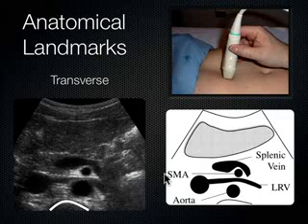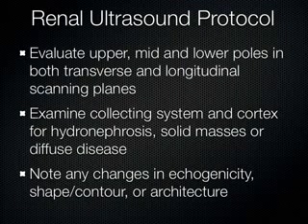So here's the left kidney, not seen on the screen. It's over here on this side of the body somewhere. And then its blood supply is sort of analogous to the right side of the body where we just were, where the right renal artery had to go behind the IVC to get to the right side of the body. Well, on the left side of the body, the left renal vein has to get over to the right side of the body to drain into the IVC. The way it does that is it gets nut-cracked between the aorta and SMA and gets into the IVC. Cool?